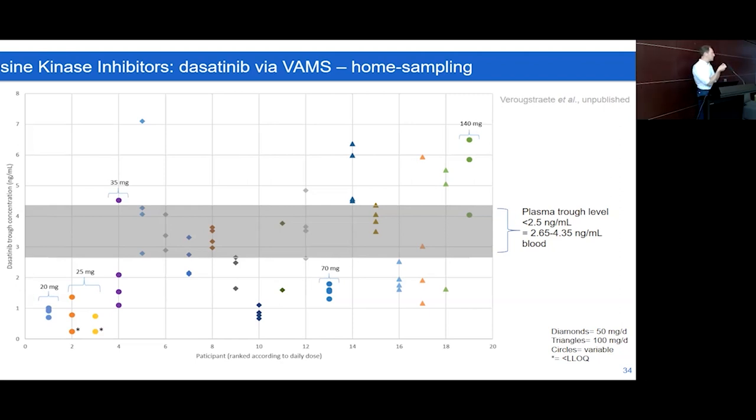So in a sense, we would need to get exactly the same concentration if someone were stable. But we can see that this is not necessarily the case. Here, this patient is quite stable. Also here, these three samples are quite close to each other, but there's one that's further off. Some show quite some variability. For instance, this patient shows quite substantial variability. Also this patient, to such an extent that you would make another clinical decision depending on what time point a patient would come.